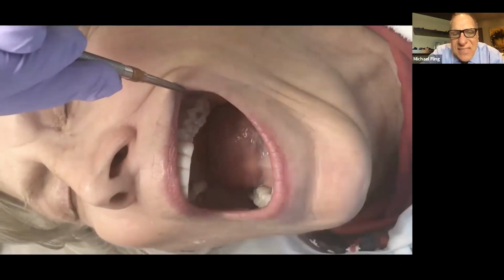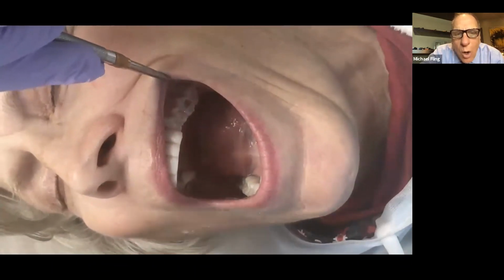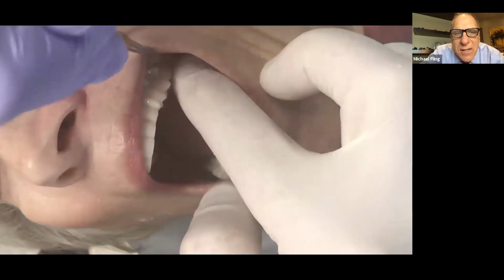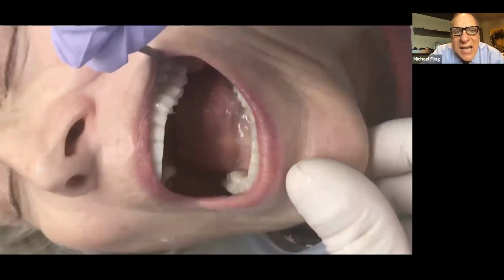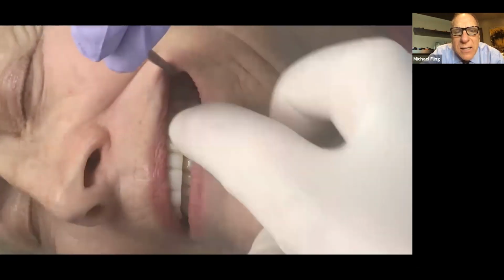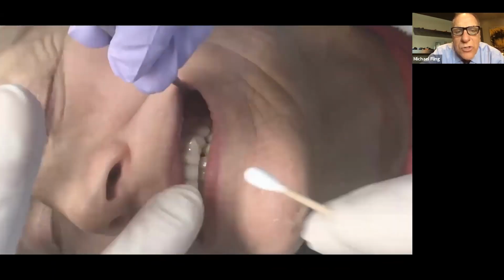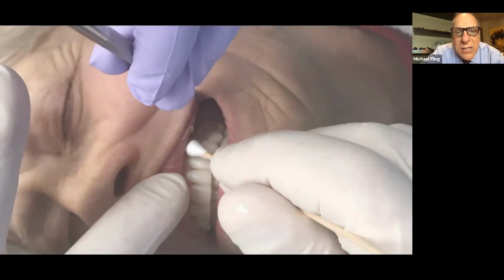Now when I seat this, I don't seat it all the way. I gently place it. I don't seat it all the way, and I ask the patient to bite. Now I can maneuver this to get it into the occlusal position that I want it.